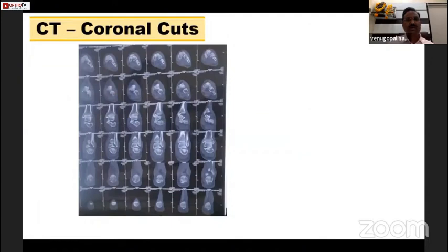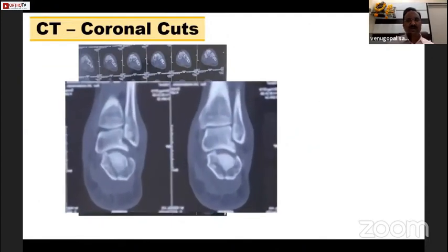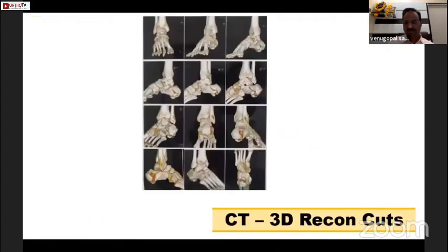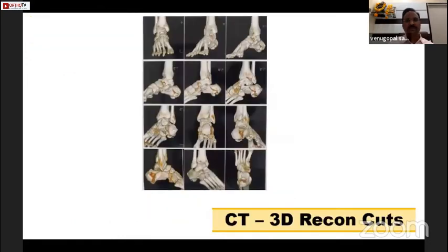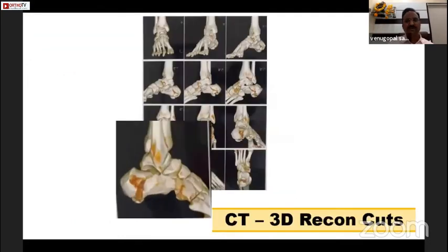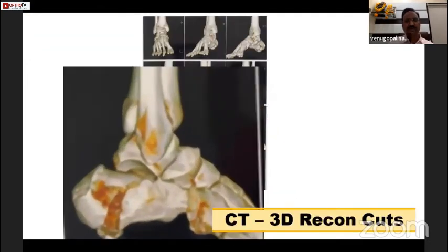These are the coronal cuts. In the coronal cuts, we can see there are three fracture lines, which confirms Sanders type 3AC. This is the 3D reconstruction of the same — we see the posterior facet has almost gone down, and the posterior talocalcaneal joint space is widely open.